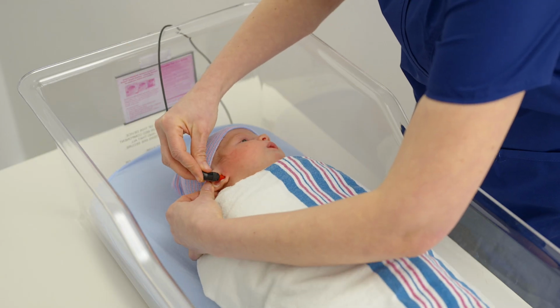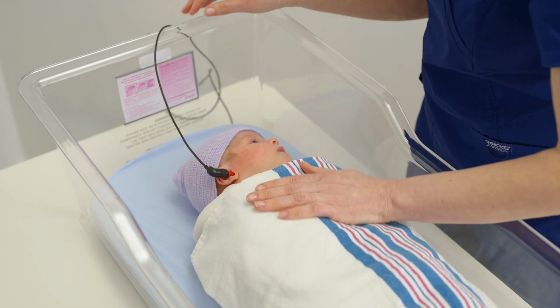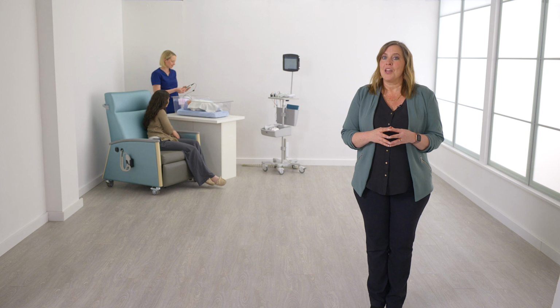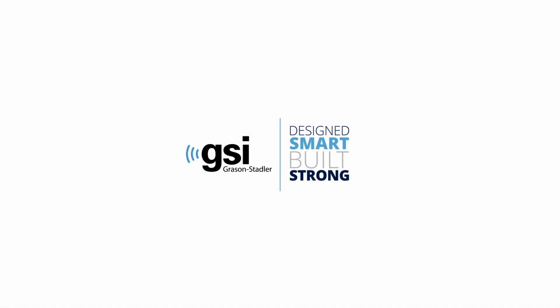Regardless of the probe style, pull gently down and out on the baby's earlobe to open the ear canal. Aim and twist the ear tip gently but securely into the baby's ear canal. Release the earlobe and ensure that the ear tip is firmly in place and will not easily fall out. It helps to position the probe cord toward the top of the head to maintain the correct angle in the ear canal. Do not hold the OAE probe during the measurement since this can cause noise.